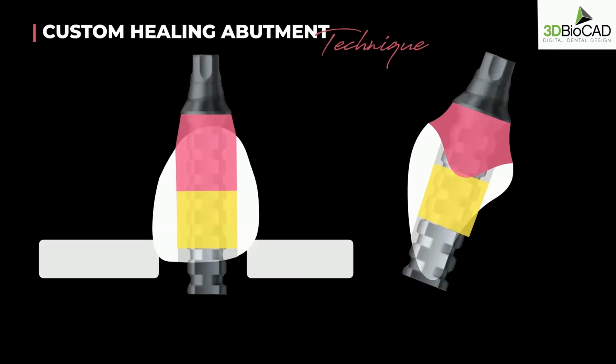The reason I do this is because then I know where I need to cut. What I mean by that is the junction between the newly added flowable composite and the shell temporary is where the gingival margin is, because that's the way we designed the shell temporary. So then I know that that's the gingival margin.